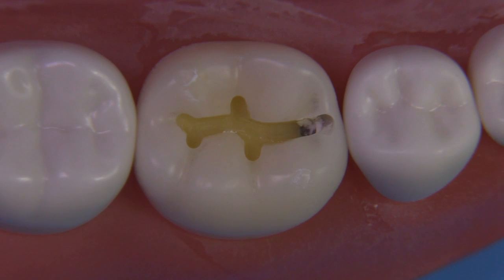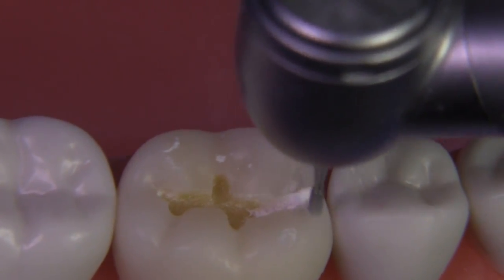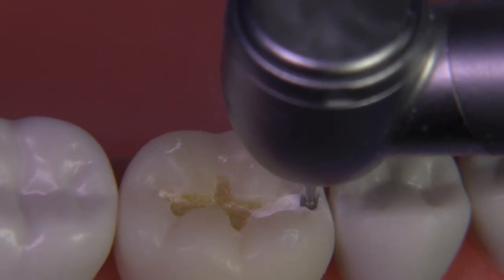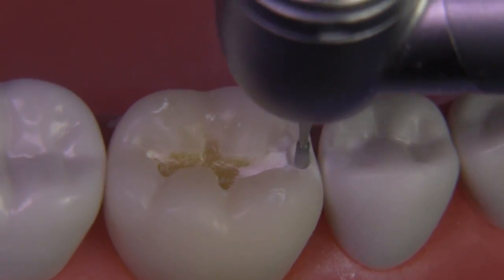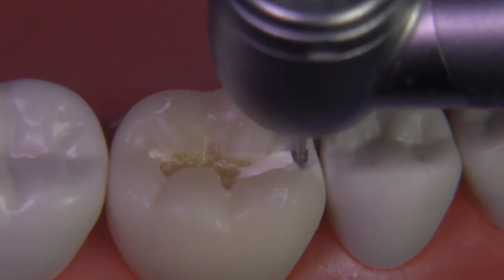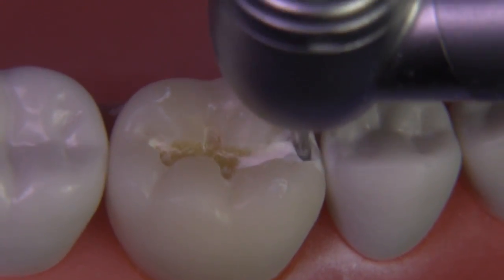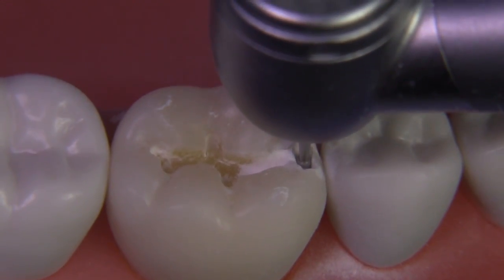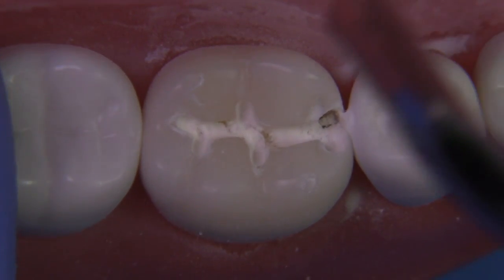So the initial outline form looks like this, and you can see immediately the amount of caries, which in this case extends significantly gingivally. I looked at the tooth outside of the mouth and saw that the caries extended towards the cervical extensively. So as we start to drop our box with the same 330 diamond, we anticipate that the gingival wall will be located significantly gingival compared to a more conservative preparation, resulting in a larger space between the gingival outline and the adjacent tooth.